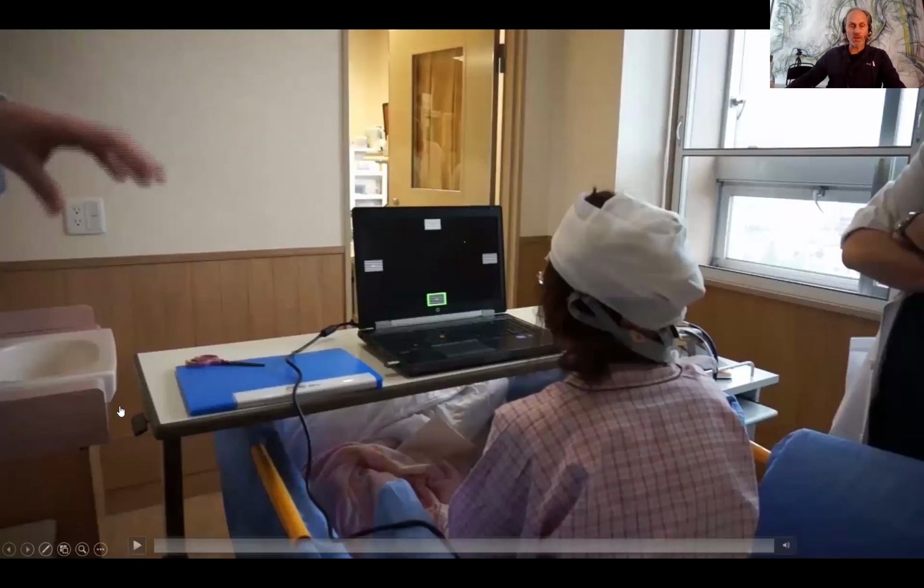This is another interesting experiment because, as you know, flickering lights can induce epilepsy and seizures. And for that reason, it was always problematic to run steady-state visual evoked potential experiments with epilepsy patients. And Christoph Kapeller, doing his PhD thesis with g.tec, developed a code-based visual evoked potential experiment.